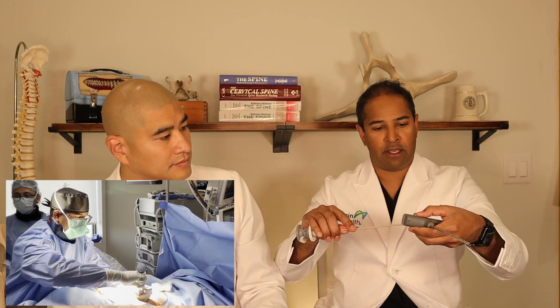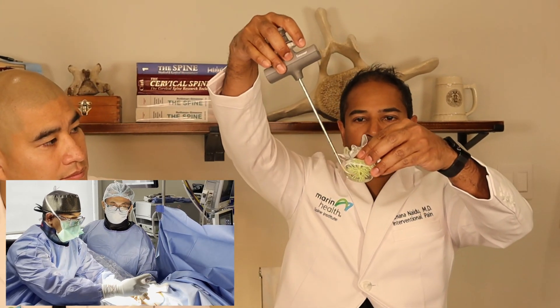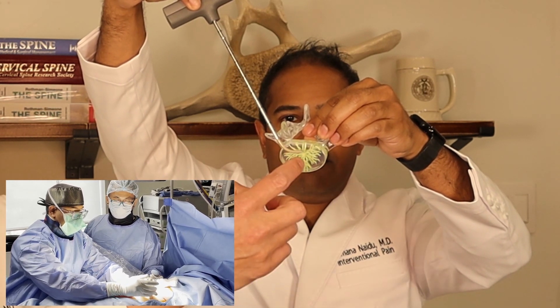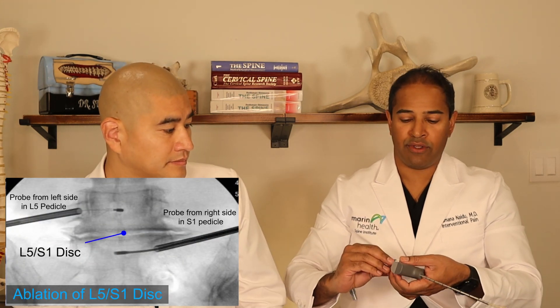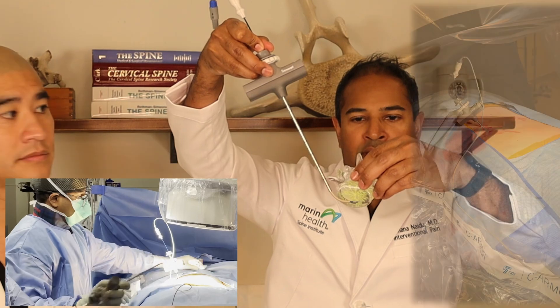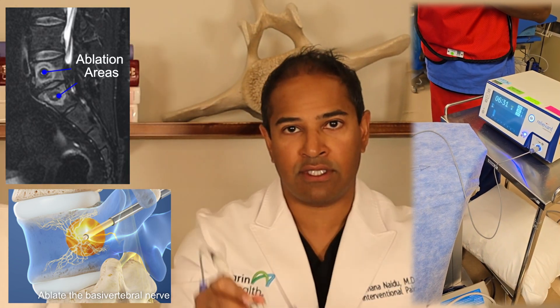Once I'm into the bone, I introduce a curved little tube that goes through that specialized needle or trocar. It curves from the pedicle towards the trunk or the base of the vertebral body, so we can get to the middle of it. We're watching all of this with fluoroscopy or X-ray — none of these instruments are placed without knowing exactly where you're putting them. I'm doing this through a really small incision, nothing is open — I'm using the X-ray to visualize it all. Once I get the probe in, it's right through that nerve, and then we connect it to a generator that ablates for seven to fifteen minutes.